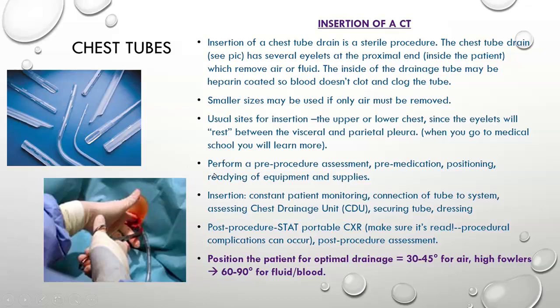As always, perform a pre-procedure assessment, medicate, positioning, supplies, equipment, consent, on and on. And then as the tube is inserted, obviously you're going to monitor your patient, and then you're going to manipulate and manage the chest drainage unit. Now, you're not going to be tested on the specifics of the chest drainage unit setup, but you should see it in the Smart Hospital on that first week, or if you're an online student, hopefully you'll get to see it in the hospital itself.